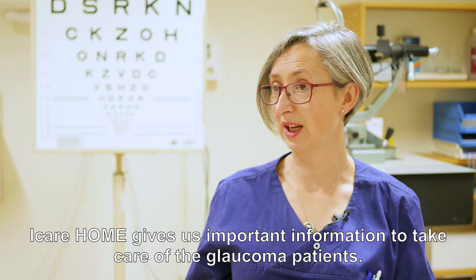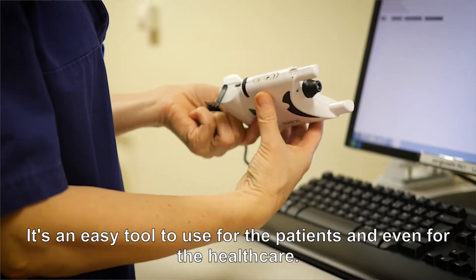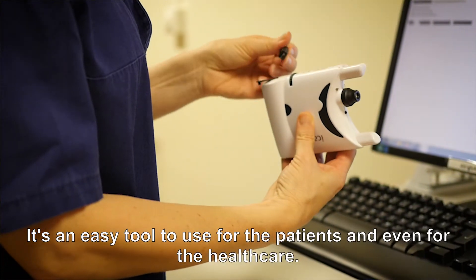I would say that iCare Home gives us important information to take care of glaucoma patients, and it's an easy tool to use for patients and even for healthcare providers.